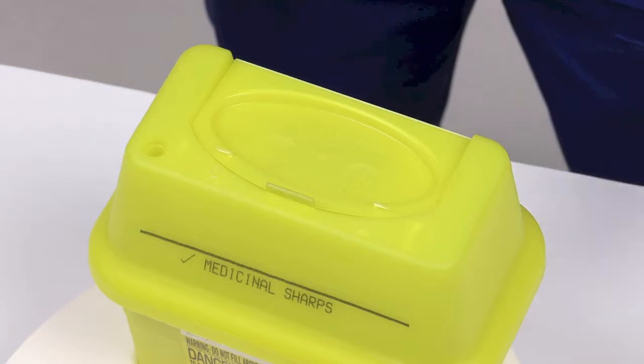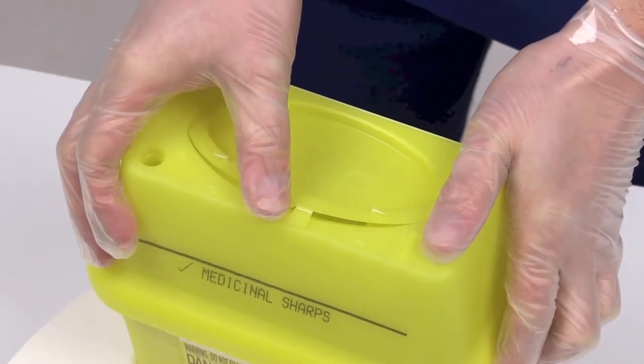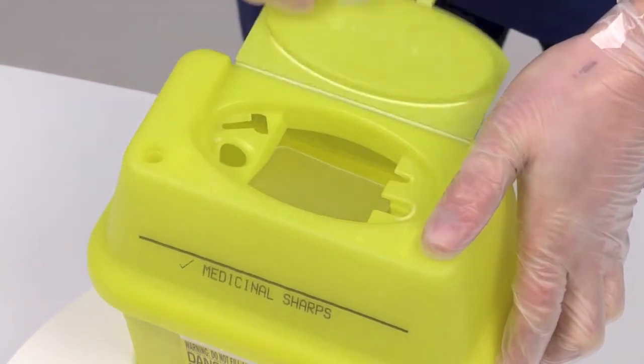Release the temporary closure feature by pressing the tab down. Fold the lid back until it engages into the open position.